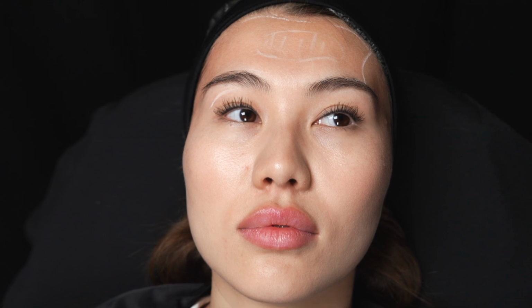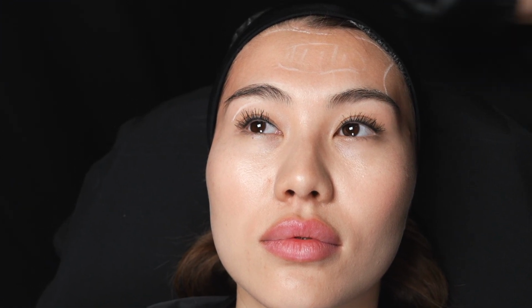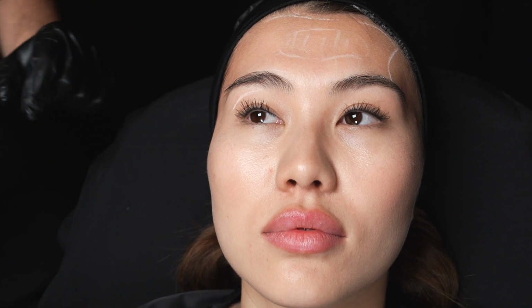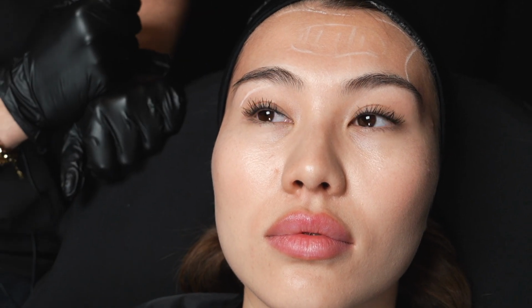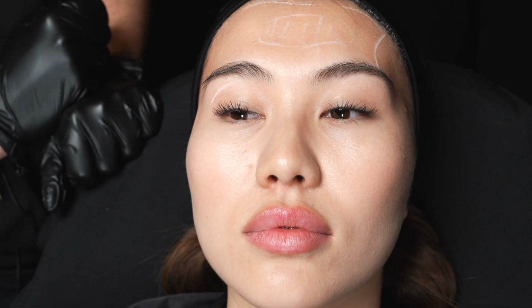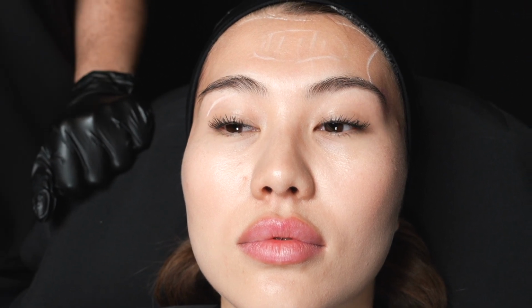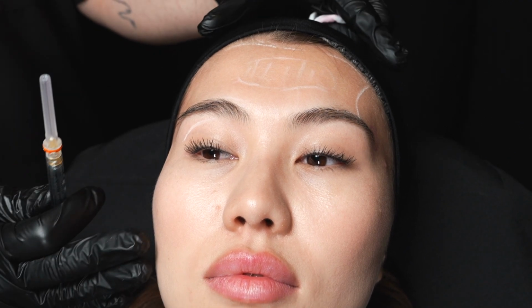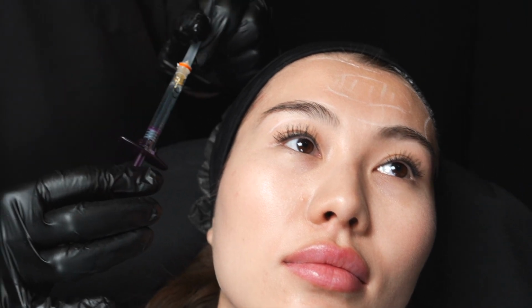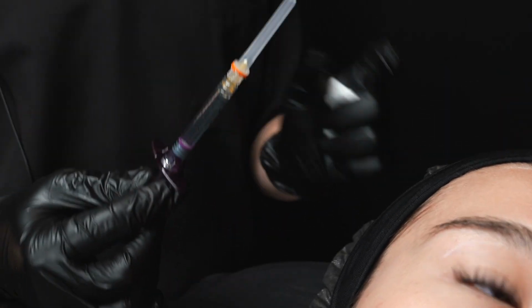Если, допустим, мы работаем с мужчинами, либо если есть необходимость введения большого количества достаточно плотного материала, тогда мы используем ультрадип. Но так как у нас пациентка молодая, ей не нужно много объема, поэтому я выбрал другой волюмайзер. Мы называем его Resilient. Это RHA4. Это резилиентный волюмайзер, неплотный, с мягкой структурой. Именно поэтому у этой пациентки я использую RHA4 для инъекции.